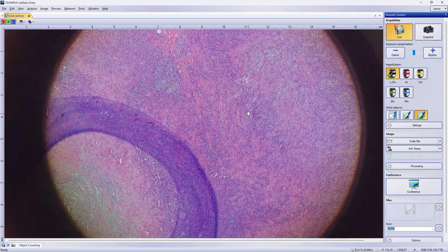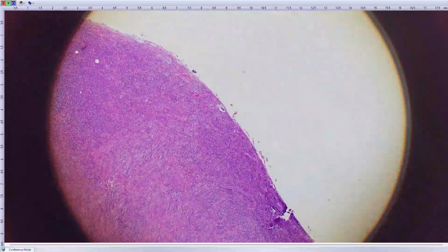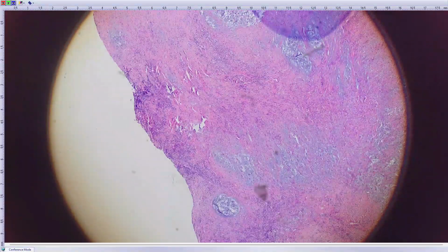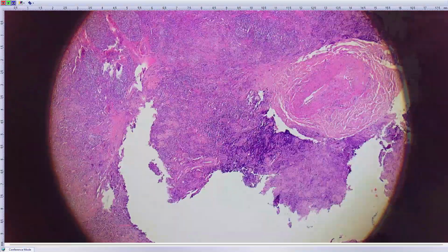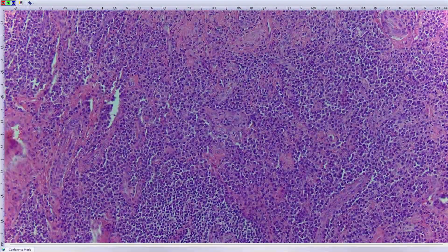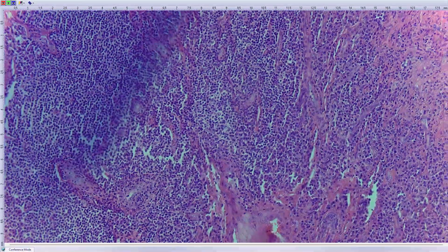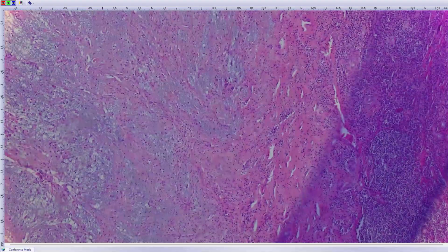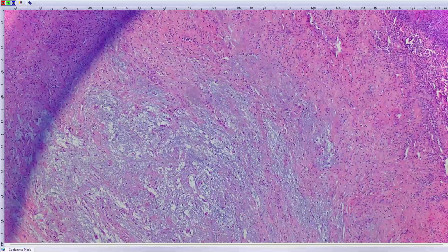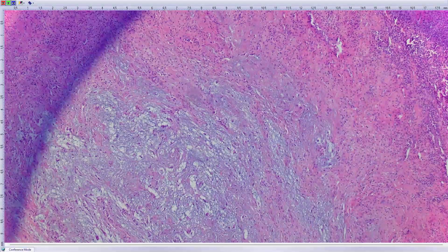Okay, this is another case, another topic. It's a finger lesion in a 70-year-old male. So I'll try to go slowly around the slide. You can notice a very prominent inflammatory infiltrate. It's so prominent that sometimes this is considered for some hematological lesion or hematological malignancy, which is quite understandable given the dense lymphoid infiltrate. But it's just one of the clues for the tumor, because the diagnostic areas are outside of the inflammatory infiltrate in these myxoid areas. Again, it's a finger of an elderly patient, which is a typical location for these tumors.